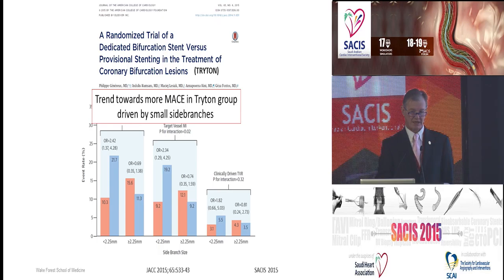So given that we have limited trial data examining the benefit, probably again trying to provide access and then a carina which is accessible, there are some other techniques which I wanted to describe real quickly, which may have put us in a position where the emphasis on dedicated bifurcation stents may not be as important.